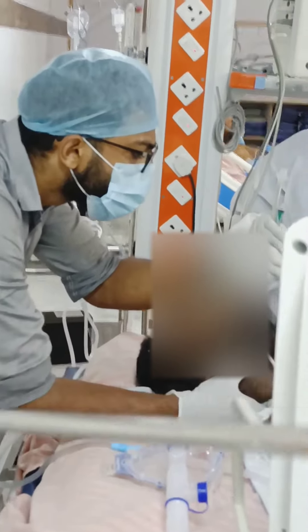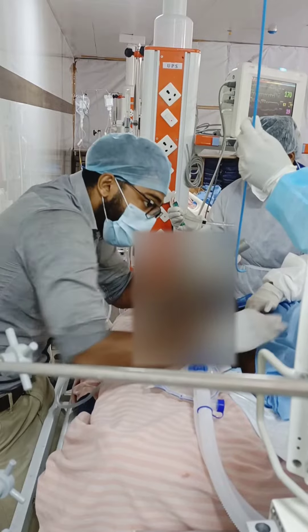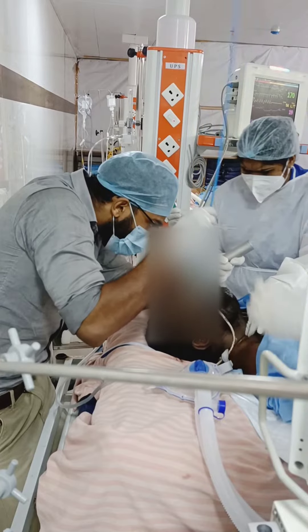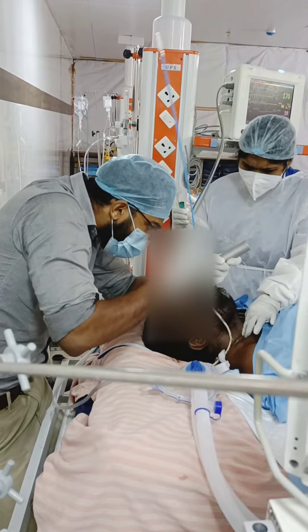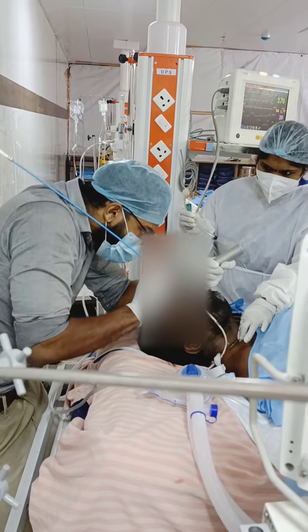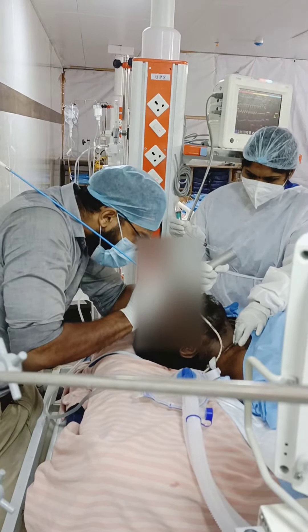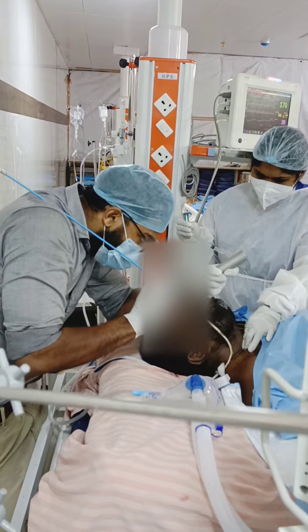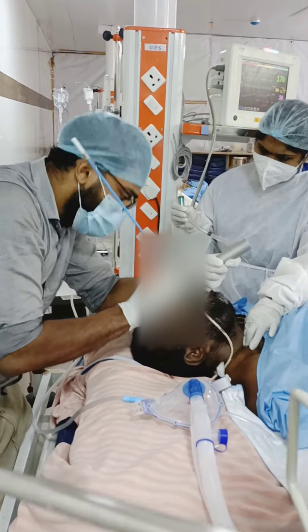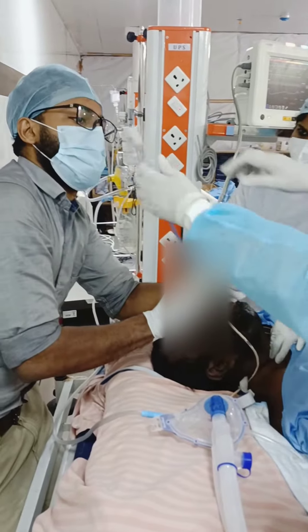This blue stick is called the Bougie. Once it's passed through the vocal cord, I can run the ET tube over it. I have successfully pushed it through the vocal cord.